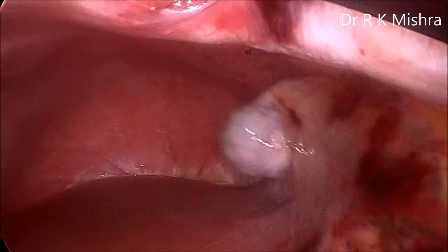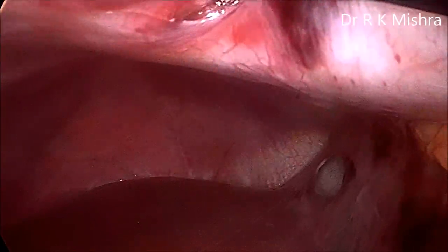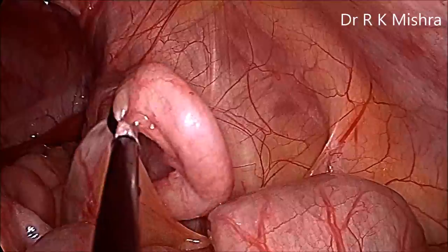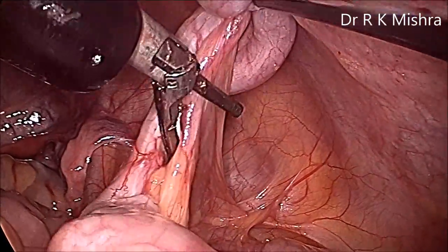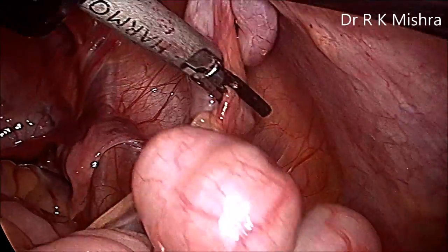After removal of the gallbladder, we switch the 10 mm cannula to the epigastric position. The same Striker mini alligator is holding, and the harmonic is now in the umbilicus. With the same ports you can also perform the appendicectomy.